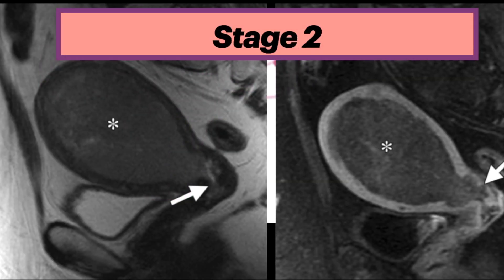Here's an example of stage 2 endometrial cancer. The sagittal T2 on the left shows endometrial cavity distension by a tumor extending into the cervix, denoted by the arrow. The contrast-enhanced MRI on the right, obtained two minutes after contrast injection, shows extension of the endometrial tumor into the cervix, with invasion of the cervical stroma posteriorly denoted by the arrow.